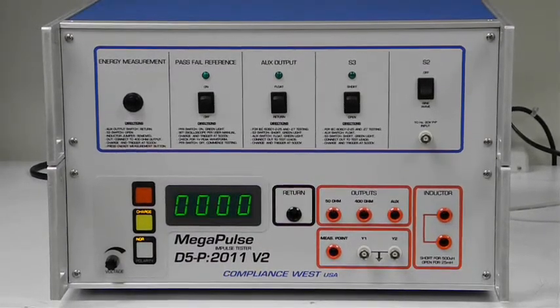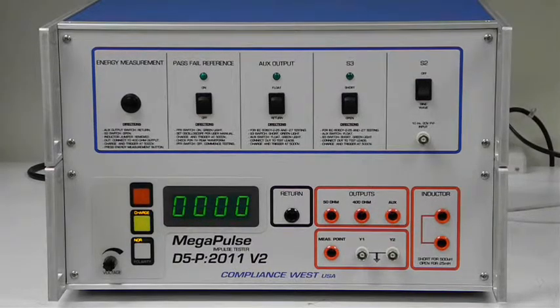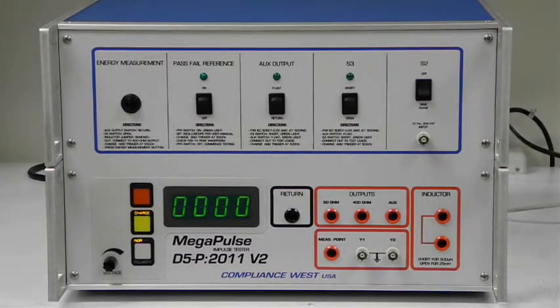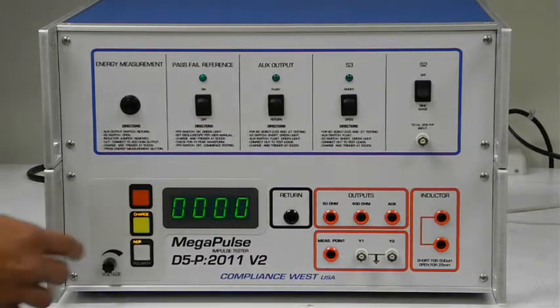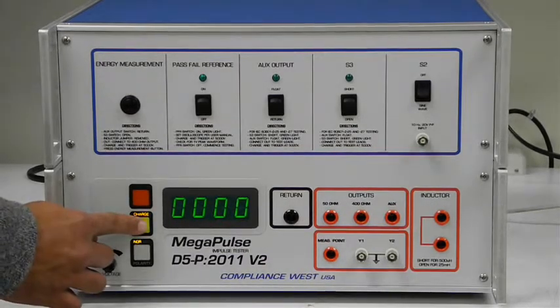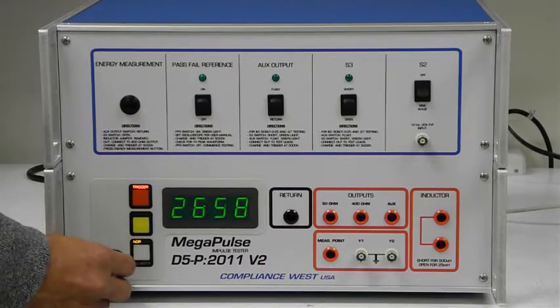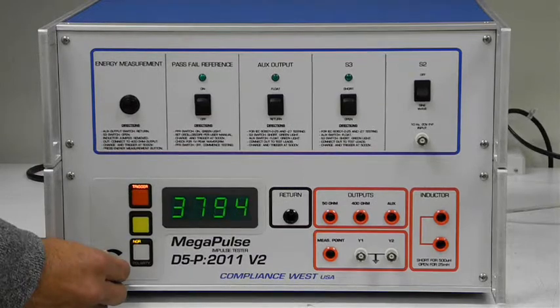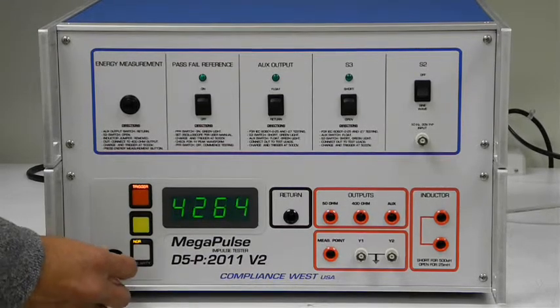This test can be conducted manually by pushing the charge button on the front panel of the D5P 2011 V2, and then pushing the trigger button when the meter shows 5,000 volts.